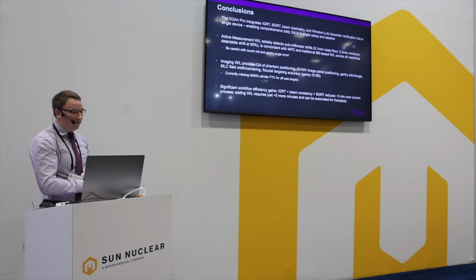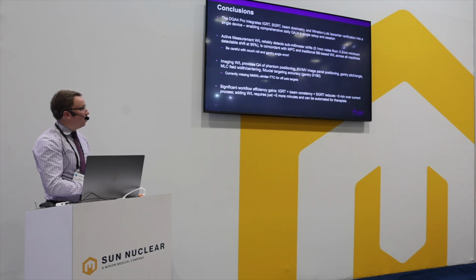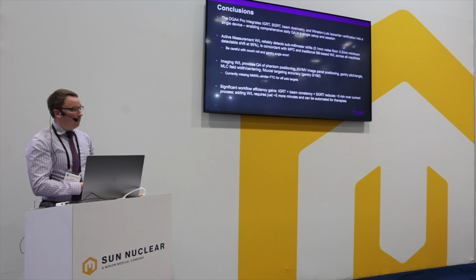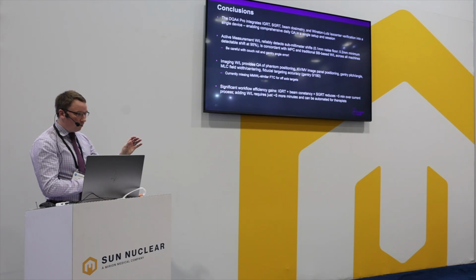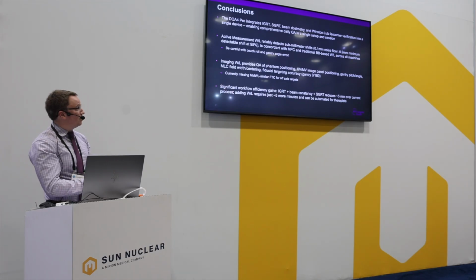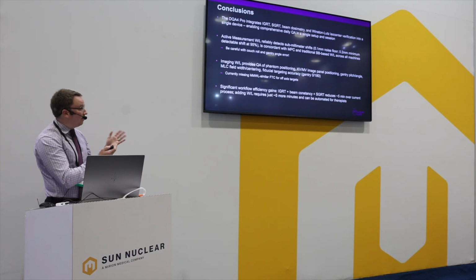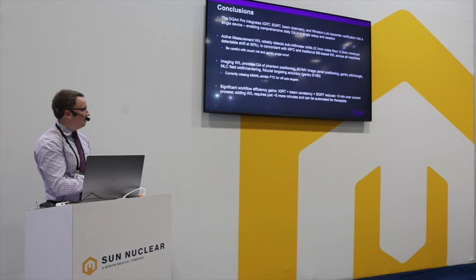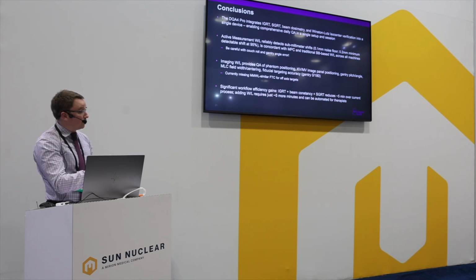Imaging Winston-Lutz provides QA of the phantom positioning, KV imaging panel positioning, gantry pitch angle, MLC field width and centering, and fiducial target accuracy, but only at gantry 0 and 180. And the one thing on my wish list that it's missing is an analysis similar to the multi-met Winston-Lutz, where you have the field to target coincidence for all the different angles. There's a ton of information coming out of the multi-met Winston-Lutz that I'd like to see here, because this has even more detectors or even more spheres for calculating this. And the other one is that it's not currently doing that phantom positioning offset with respect to couch, which I think it really needs to do.